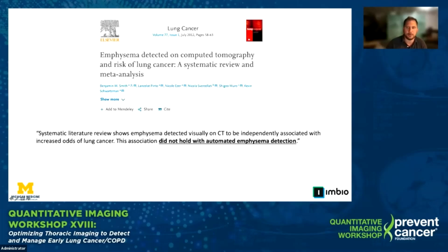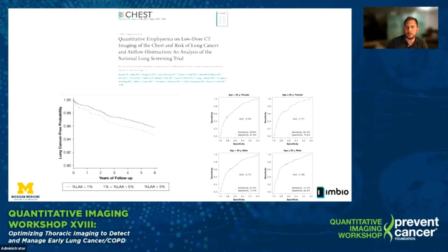We hypothesized that protocol standardization was the reason for this. So we performed our own analysis and published this result last year, showing that indeed there actually is an association between quantitative assessment of lung density and lung cancer diagnosis in the NLST. But this relationship was only significant if we filtered out scans that were reconstructed with very sharp kernels or very large slice thicknesses. Additionally, we pre-processed these low-dose scans with a noise reduction filter that harmonized them to be more similar to standard dose scans.